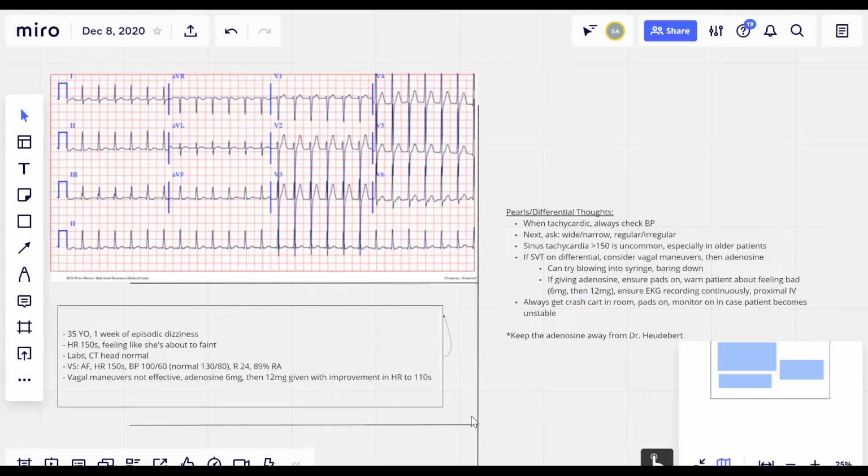That's kind of my... Yeah, and could you mention, you had something in the chat about the event monitor, and I've diagnosed a couple people with event monitors, but when someone comes in the emergency department and gives you this story and you're not going to admit them, when do you think it's worthwhile to get an event monitor, and when is that going to be too frustrating?